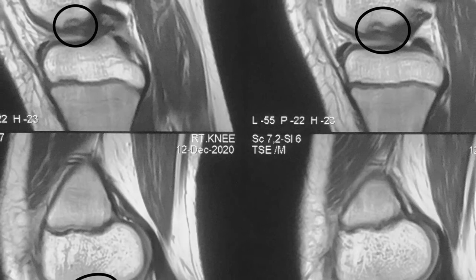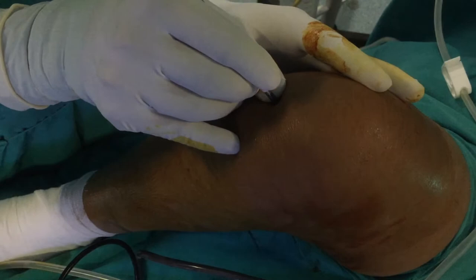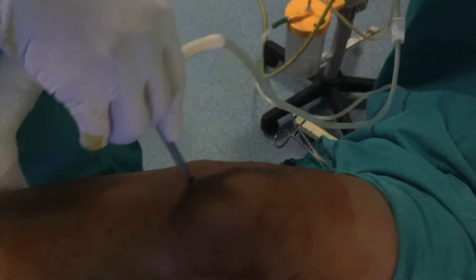Now we are starting diagnostic arthroscopy of the knee joint. This is the lateral portal, and now I am inserting my trocar and cannula into the suprapatellar pouch.